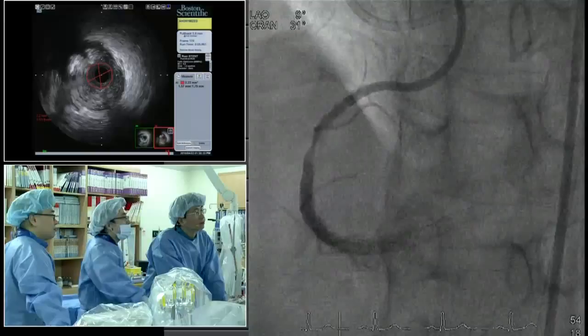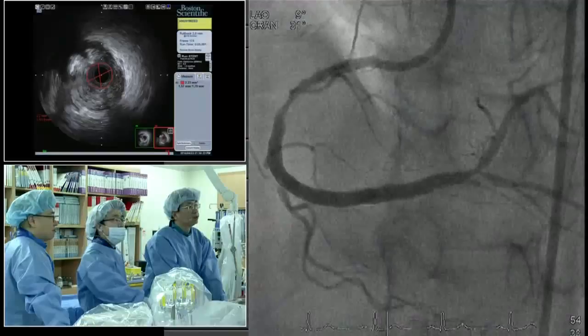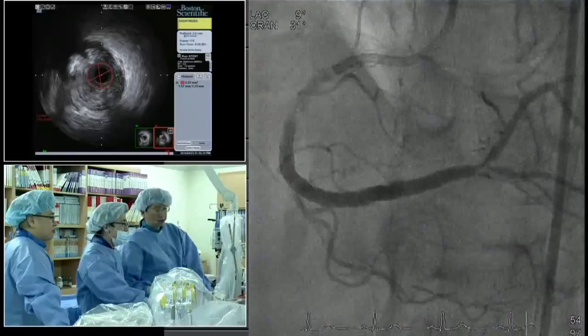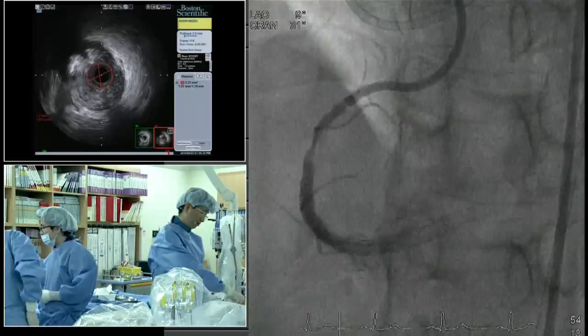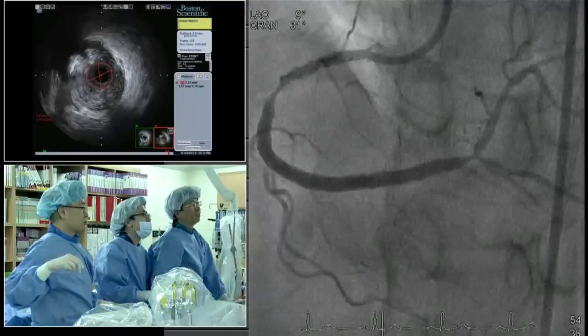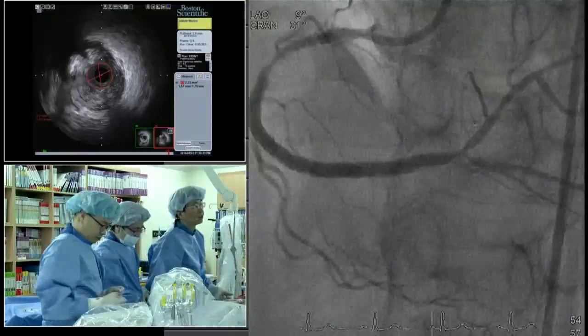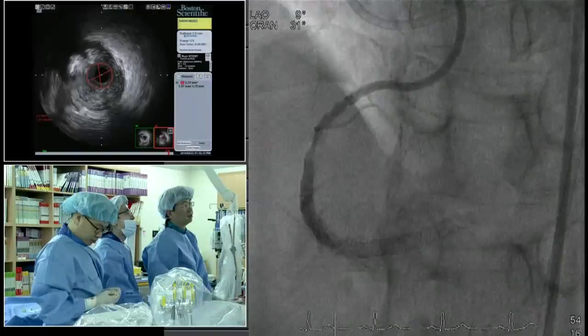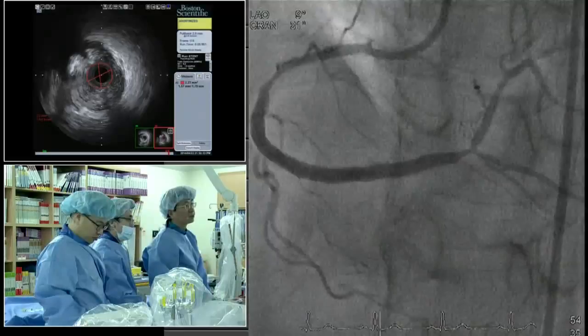However, I wanted to think about the patient's stent. Dr. Wang, it's an inappropriate procedure. If you perform the balloon dilatation, you can make a dissection. Then you put another stent. It's inappropriate. So I sincerely want aggressive medical treatment and to wait and see the response of the patient because of the very long segment stent. I also agree with Dr. Hansik Bach. I want to avoid complex stenting for this bifurcation region. So I want to watch and defer for this region. So I really want to just leave it alone.